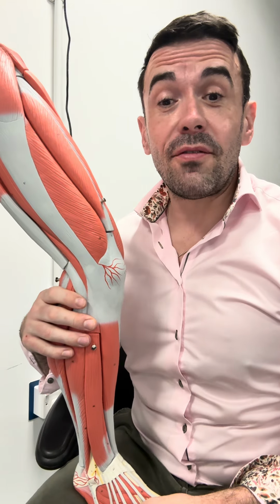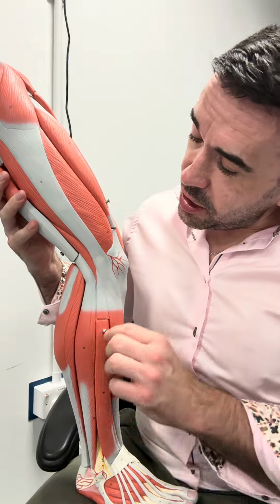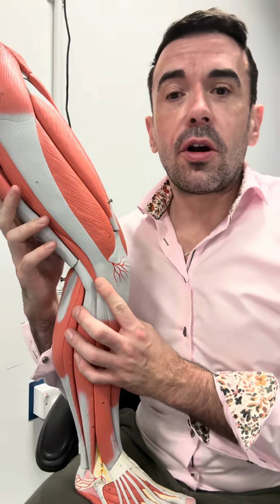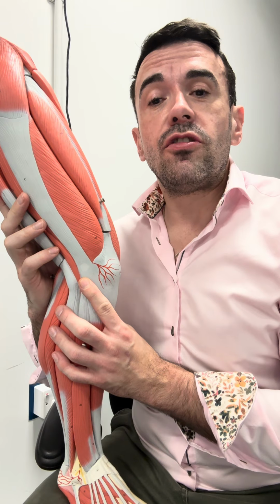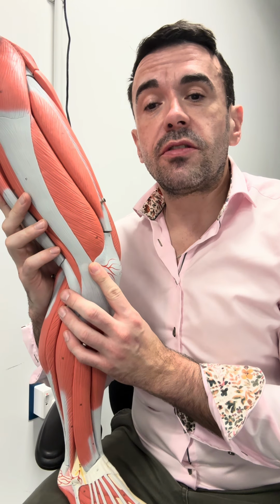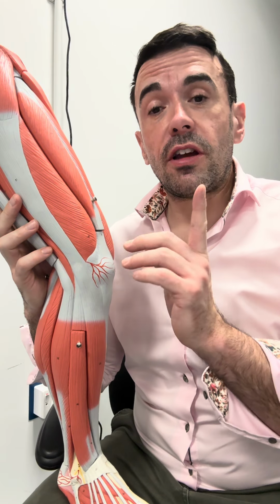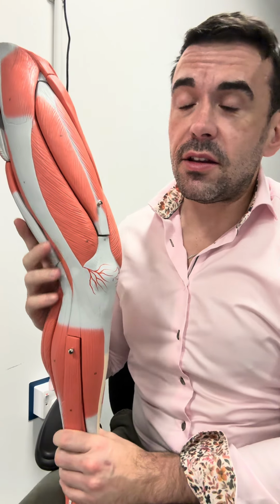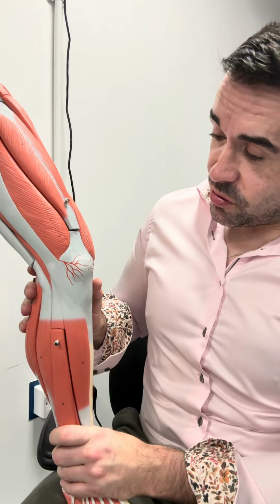Hello. For this short video, we're going to talk about how to find the lateral femoral epicondyle so that we can find the axis of rotation for the tibiofemoral joint so that we can align this with the axis of rotation of the dynamometer head. And I'm going to use this leg here as a demonstration.